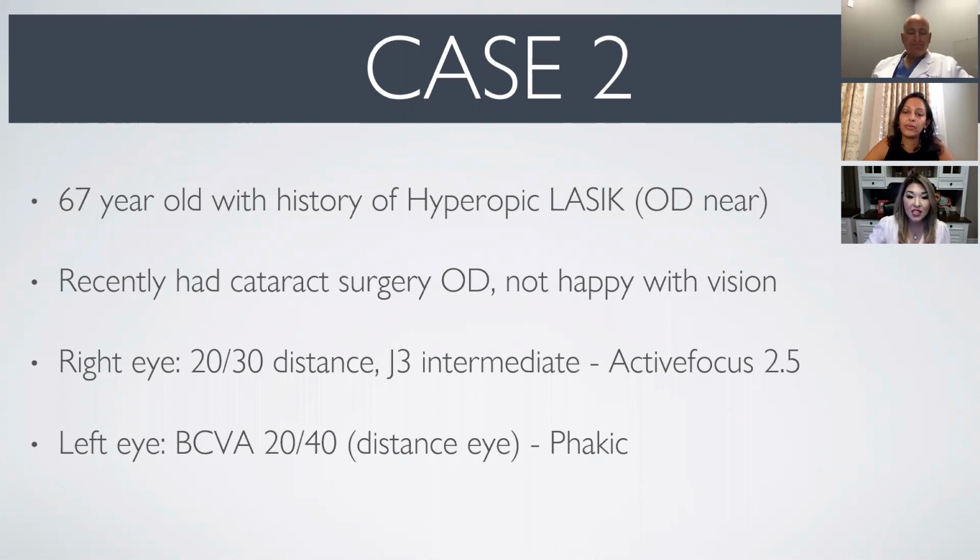So, in a scenario like this, if it was a refractive error plus you've got PCO, but they were never happy, you're not going to do the YAG because the refractive error correction is not going to make this patient happy. So certainly looking for the regularity of what their LASIK bed looks like, and also asking them, I would go back even a little further and say, after LASIK, how was your vision? Were you happy then? What was your nighttime vision like? Because all of that quality really plays into a role as to what lens option we should be considering given their various lower and higher order aberrations here.